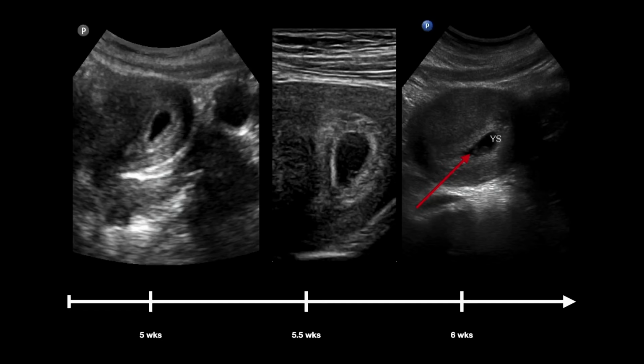But if we go back to this notion that in early pregnancy there are particular sonographic findings that are decently consistent from pregnancy to pregnancy. In fact, they're really consistent. And so you think about it, in that 5.5, 6 week mark, there's a lot going on sonographically that is pretty consistent from pregnancy to pregnancy, right?